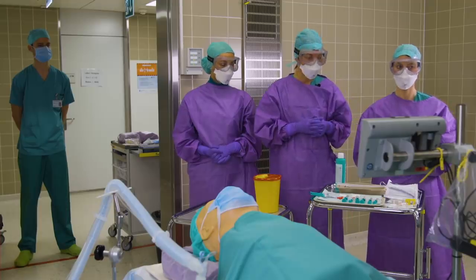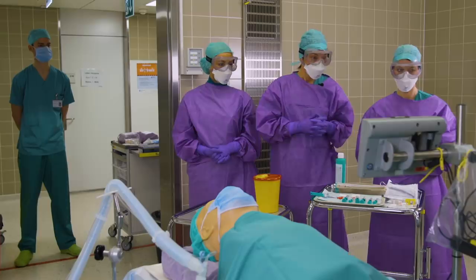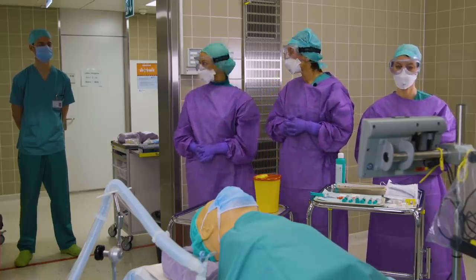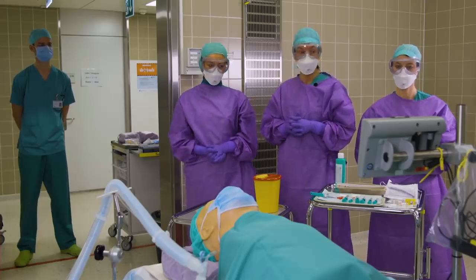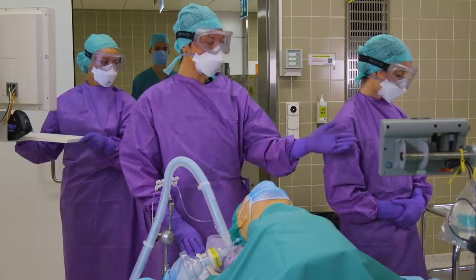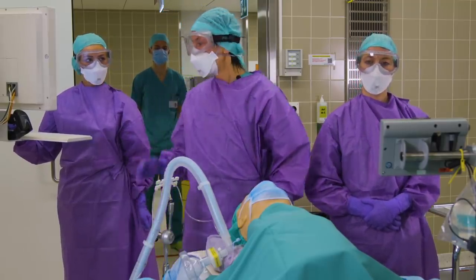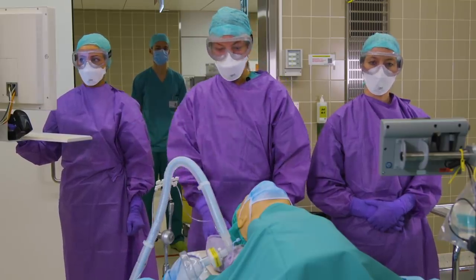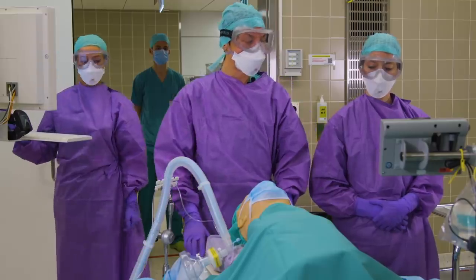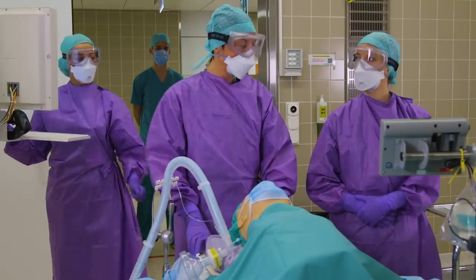Outside, we have Tim, who is our clean person and jumper. In case we need medications or airway material, he will be able to hand them to us. We designated our roles clearly, with Larissa being the medication person and airway help, Manila doing the documentation, Tim outside as a clean person, and myself as a seasoned anesthesiologist doing the airway.